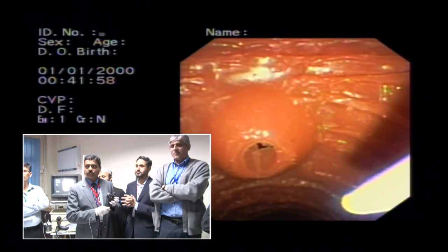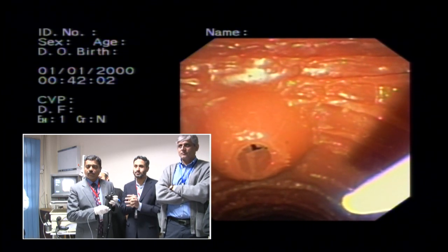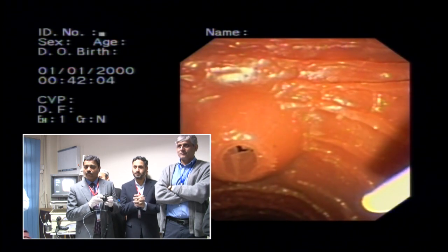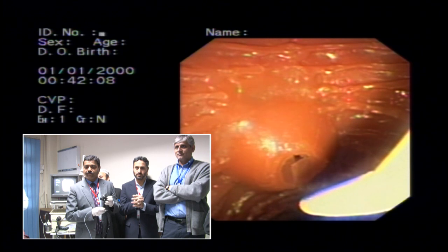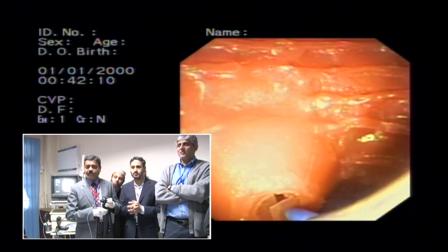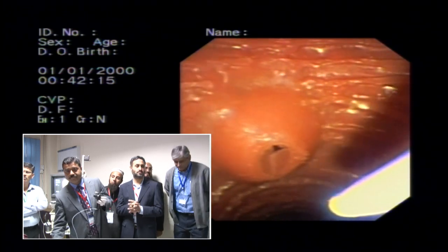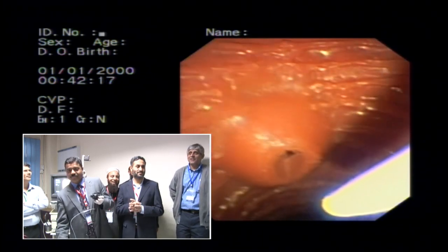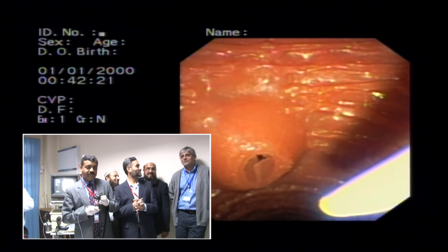In fact, I learned ERCP on the old fiber optic scopes. In those, you are trying to watch the screen, so small movements are not so visible, and we do like this. And then automatically you move with it and you would stay like that. You must have seen that. I did my last fiber optic ERCP, believe it or not, last week.